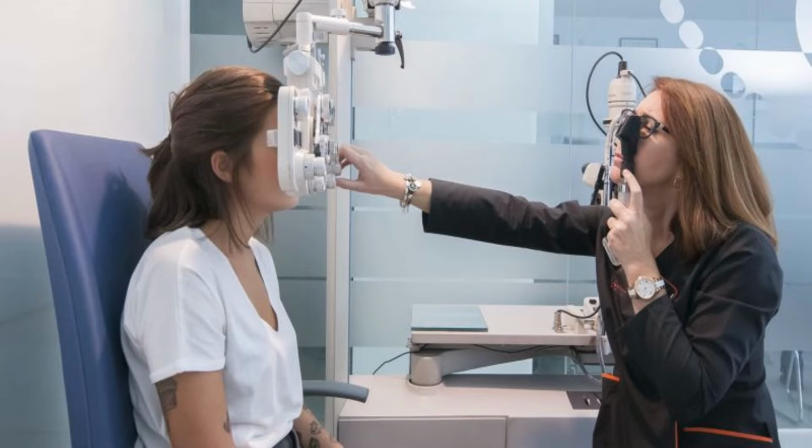So working distance is the distance from the retinoscope to the patient's eye. From a theory point of view, working distance would be best if it could be the standard distance for measuring visual acuity, that is 20 feet or 6 meters, which is practically not possible for performing retinoscopy. For the reasons that, first of all, the reflex would appear very small, and second, it is not practical to change lenses at that distance while doing retinoscopy. Therefore, retinoscopy is generally performed at arm's length from the patient's eye.